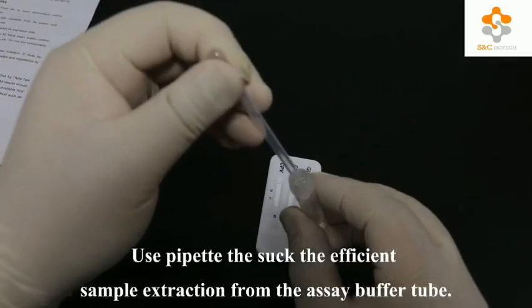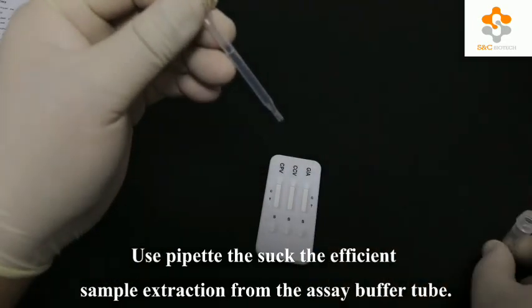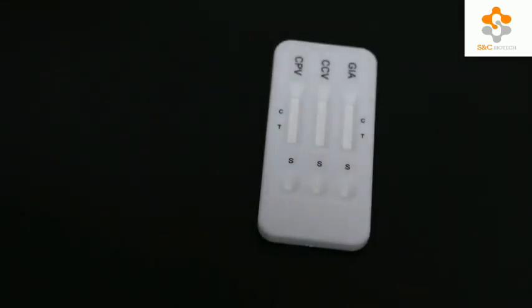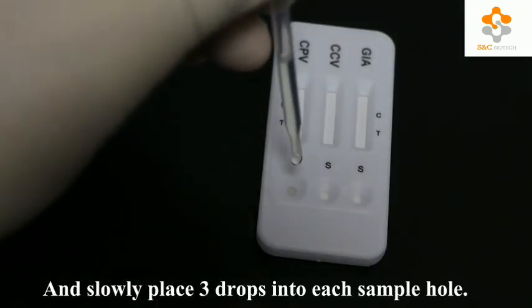Use a pipette to draw the extracted sample from the IC buffer tube, and slowly place 3 drops into each sample hole.